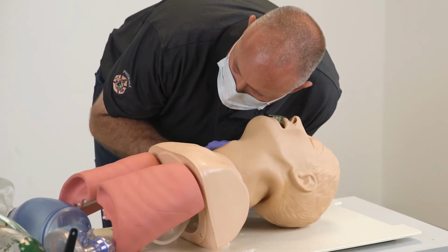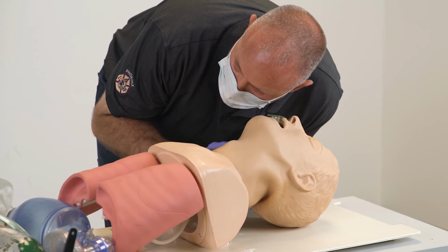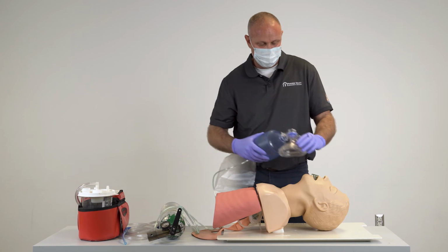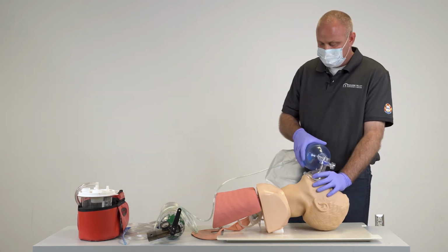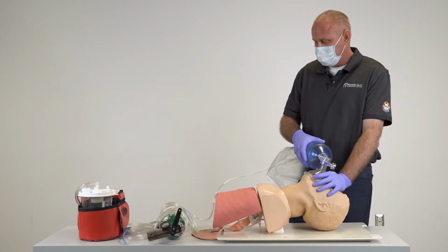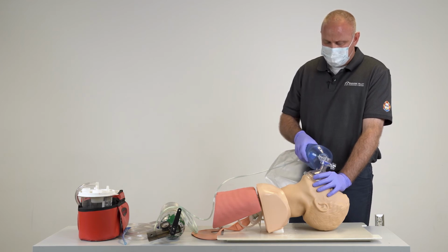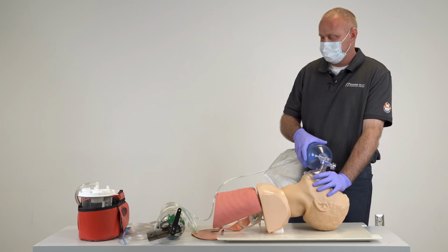I'm going to look, listen, and feel. I'm still apneic and I still have a weak pulse of 60. I'm going to go ahead and continue to bag. I'm going to bag again 10 times a minute, once every 6 seconds, and I'm going to look for equal rise and fall. I'm going to feel for good bag compliance and condensation in my mask.